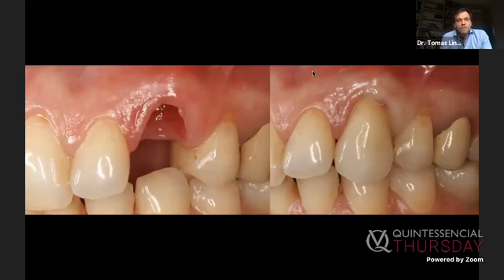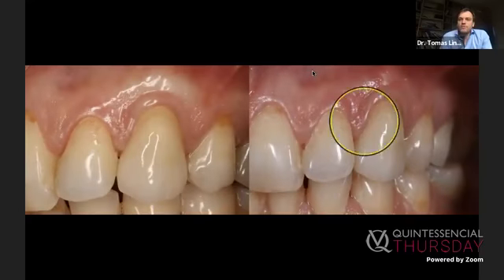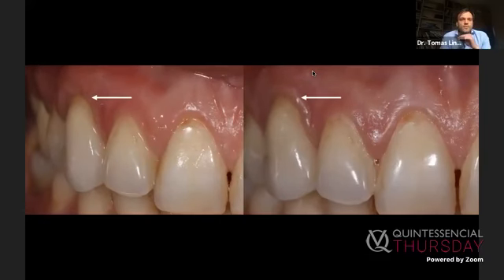And then we have now delivery of super polished zirconia restorations. And I just want you to notice what's happening with the contour. So you have the delivery. This is after a few years follow-up. And this is, I think, after 3 years follow-up, we actually see the growing of the tissues, making them a little bit thicker. Now, this is just at the delivery. This is the 3 years follow-up. And if you enlarge, you can clearly see the difference.